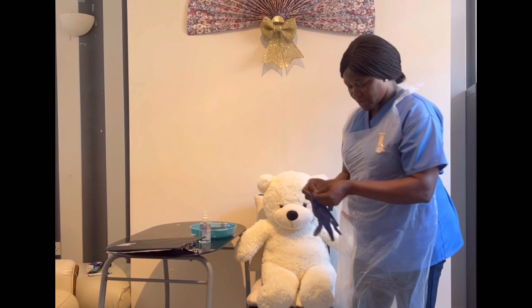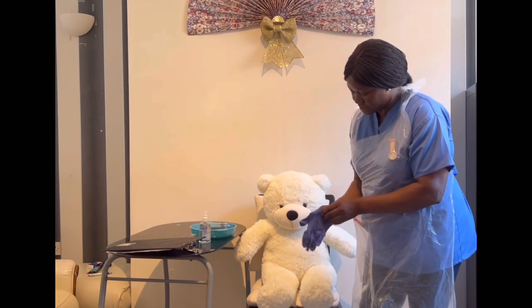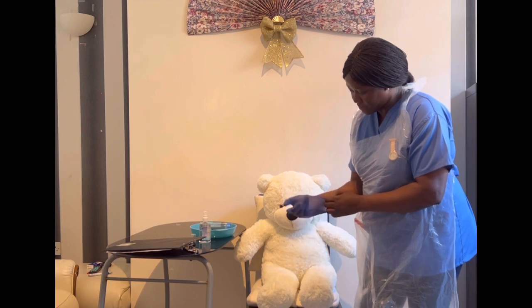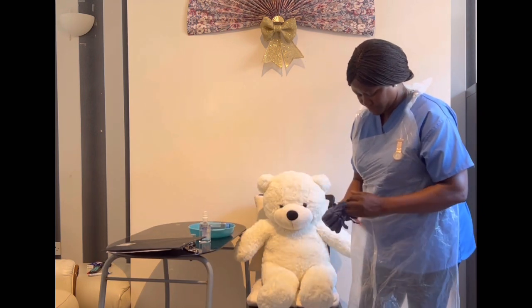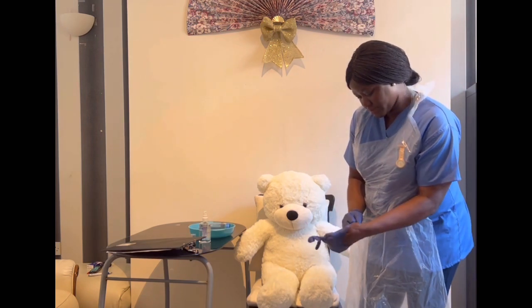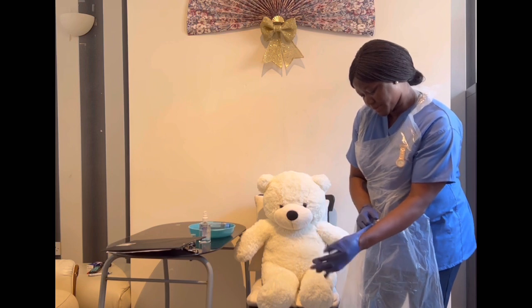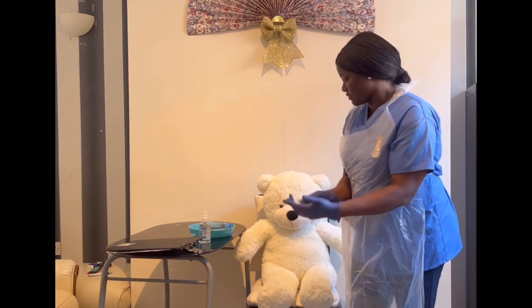I'm going to put on my gloves. It's a clean procedure, so I'm using clean gloves.